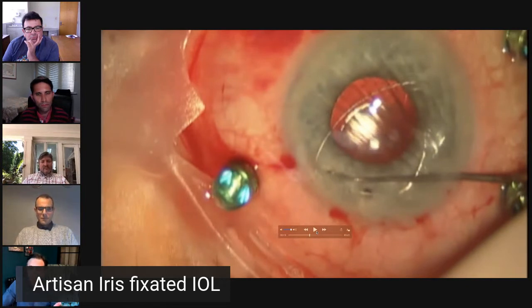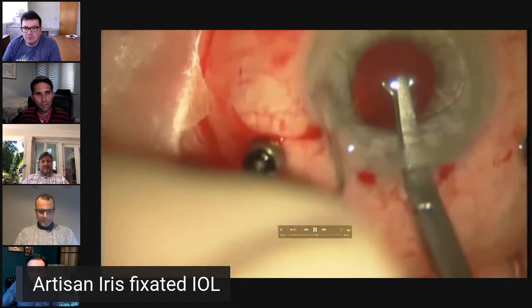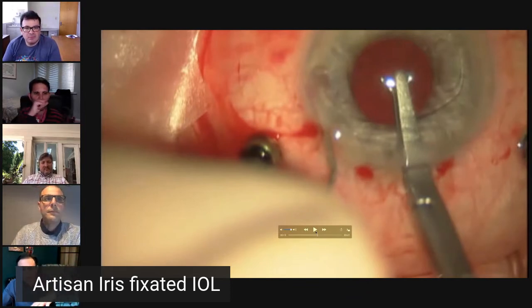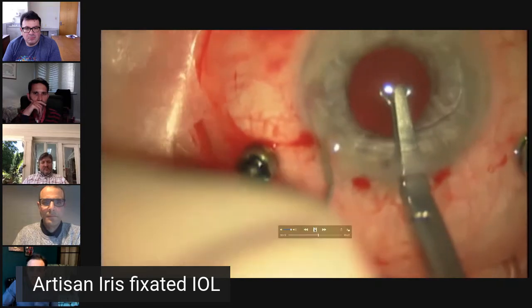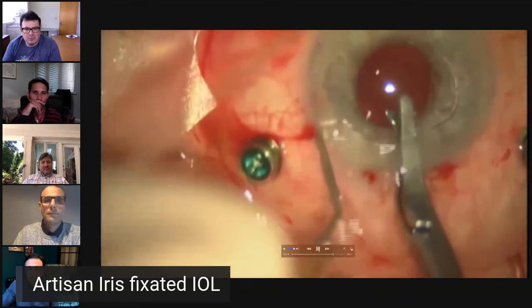The reason for this is that you don't want to be shoving and struggling and making your life difficult. So just make your life easy in these cases, and then rotate it in whichever meridian you think is best. Remember also that this lens, the Artisan lens, is concave, so there is a tilt to it. Depending whether you're inserting it into the anterior chamber or posterior chamber, you need to put the concavity of the lens away from the iris. Once you position the lens in the correct meridian that you want, you just hook it to the two clipped arms.